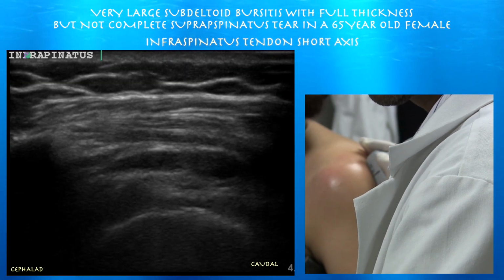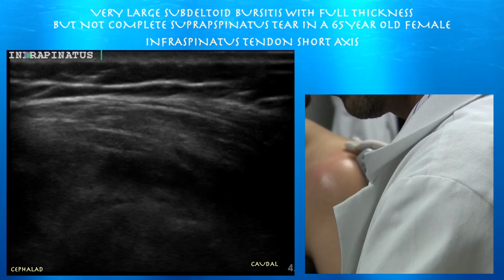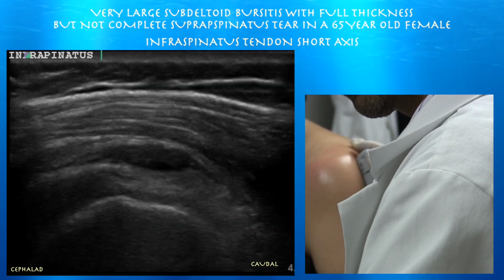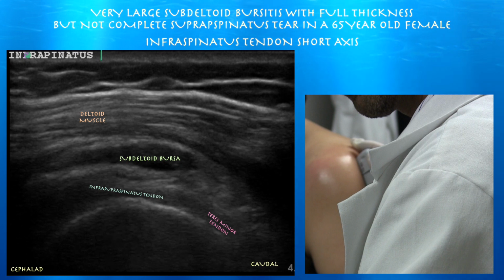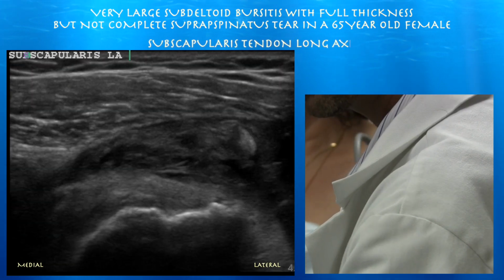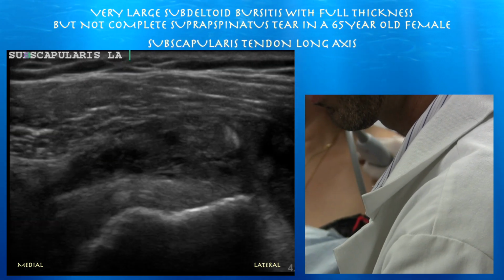Now we're going to go ahead and look at it in short axis. Right side of the screen is towards teres minor. Teres minor and infraspinatus in short axis also appear normal. We're going to have her passively go through some motions here.